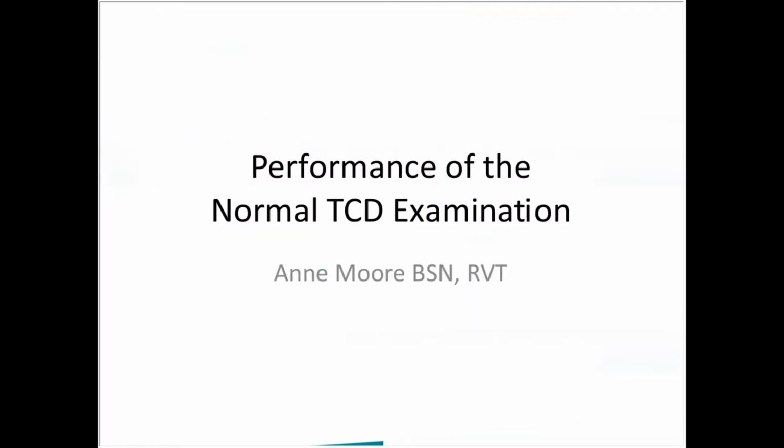There, thank you. I'm going to talk today about the performance of a normal transcranial Doppler examination and hopefully give you some tips and tricks.